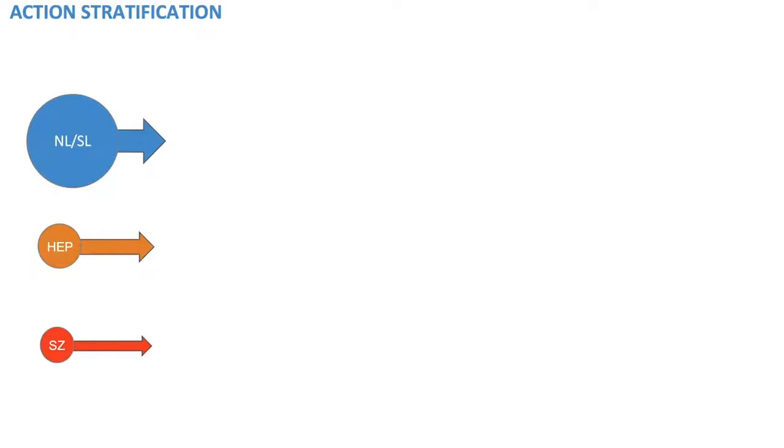The EEG course that we have planned is basically inspired by the idea that we are not going to be counting trees or describing fancy terminologies for you to read the EEG with, but we are describing a way of thinking so that you can read the EEG to stratify your actions in at least 3 ways.